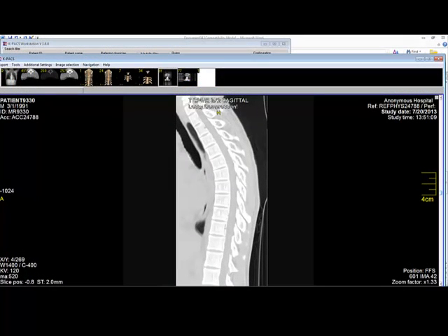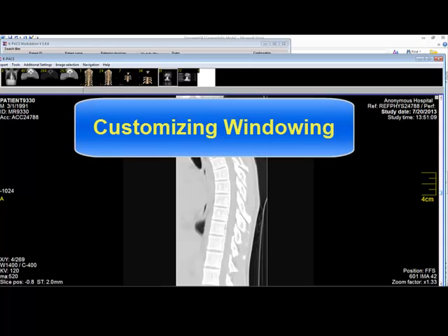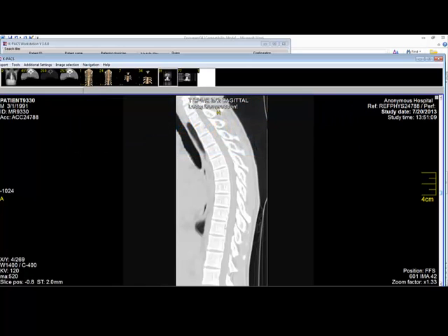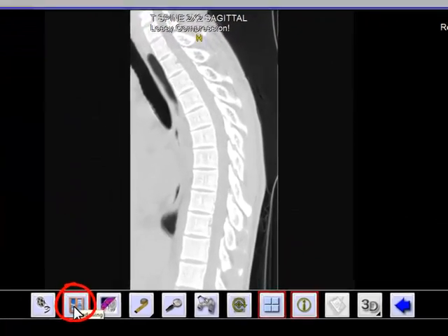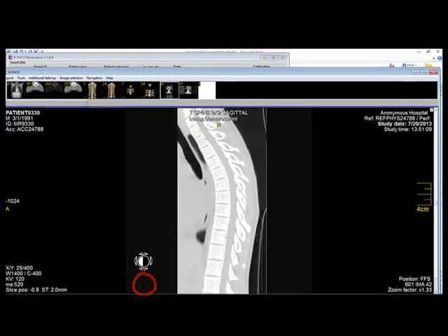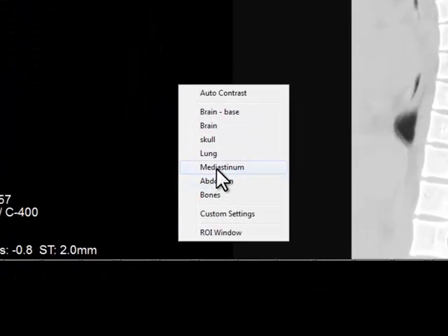Sometimes it is desirable to use a windowing that is not provided by the presets, in which case you have to customize the windowing. That's easy to do. First you take your cursor to the bottom of the page and select the windowing tool. I am going to preset this at mediastinum.